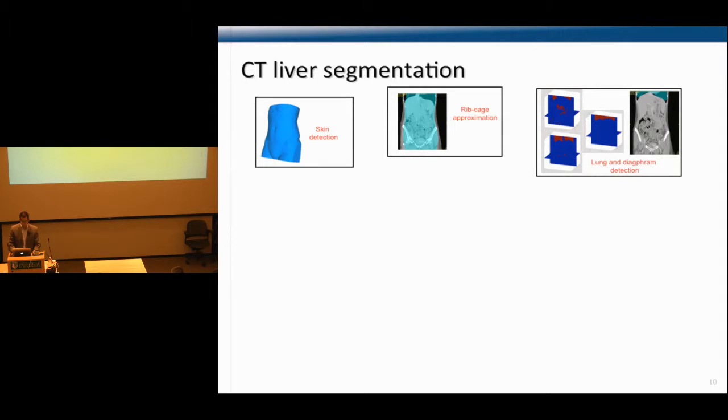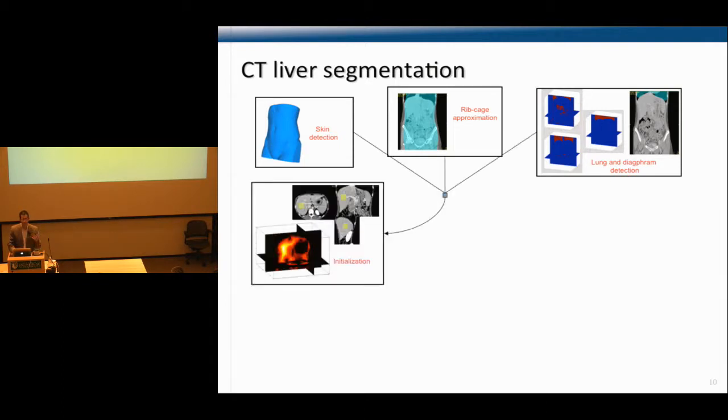So one of the technologies we developed is a CT liver segmentation technique, which will really be able to delimit the boundaries of the liver from a CT image. In the technique, you'll see a lot of workflow diagrams. As I'm an engineer, I like to put a lot of workflow diagrams. So that's to show how the liver segmentation technique works for a CT.